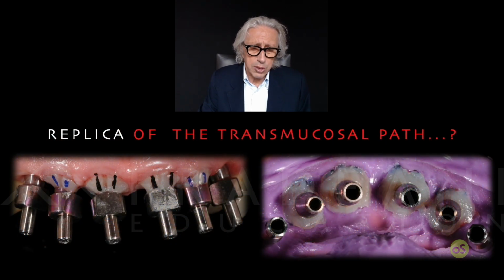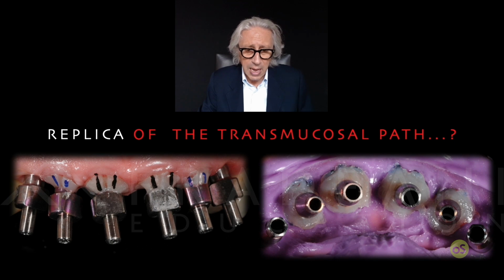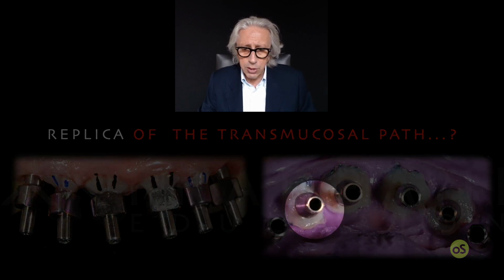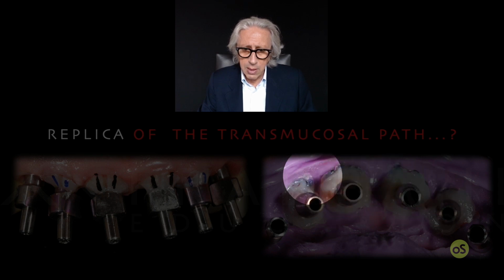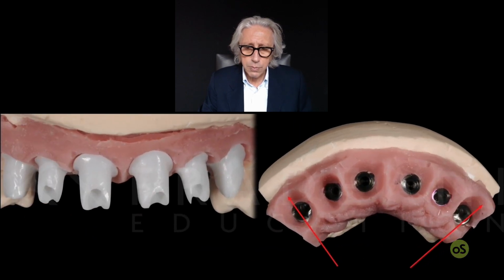Once you do, you position this impression coping, customized in this way, into the mouth of the patient. We didn't do that on the 2 cuspids, the right and left. Why? Because we had no chance to replicate something that was tested in the patient's mouth, because the patient was rushing us. You have to finalize in 1 month because I have to leave to go to Australia. So that's the reason why we had no time to do our best. But anyway, we tried to do our best. And that is, again, the way we conditioned the soft tissue with the provisionals, but not on the cuspids, without resin, without any kind of conditioning there.